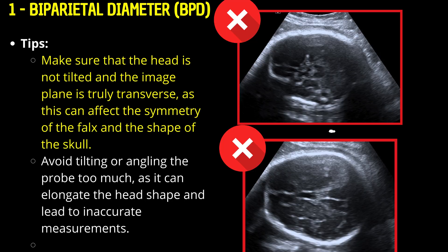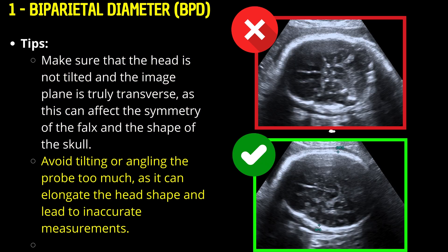Tips for BPD: Make sure the head is not tilted and the image plane is truly transverse, as this can affect the symmetry of the falx and the shape of the skull. Avoid tilting or angling the probe too much, as it can elongate the head shape and lead to inaccurate measurements.